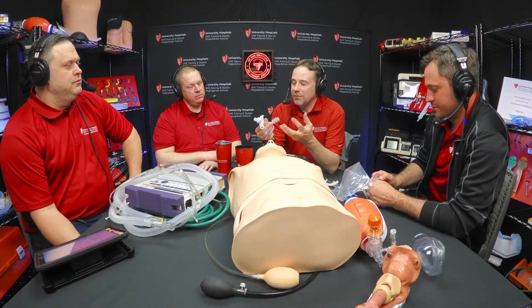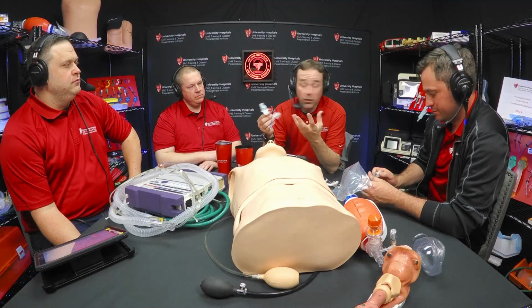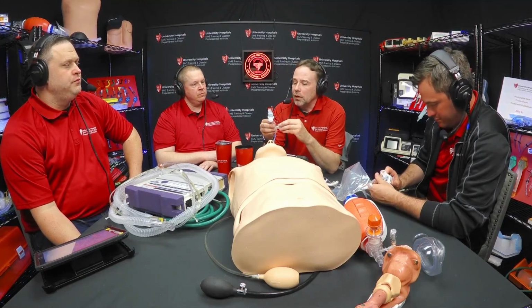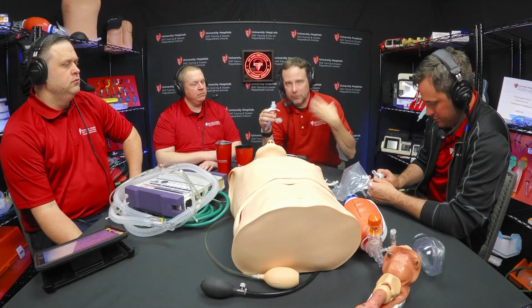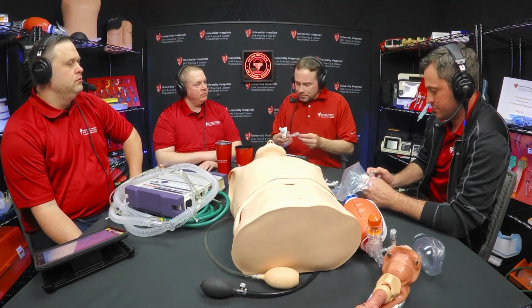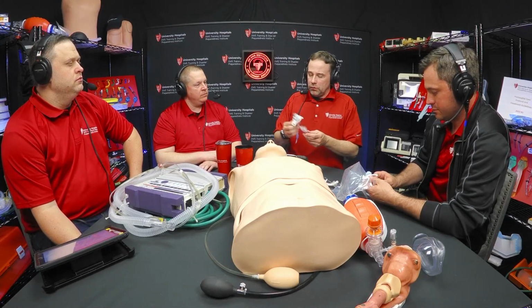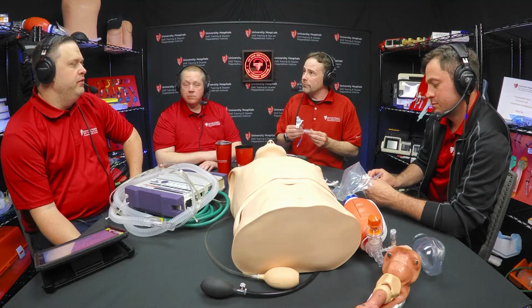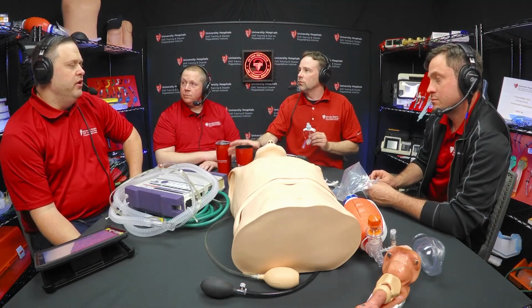And if that patient was breathing substantially on their own, you wouldn't necessarily need to bring that up or do anything, bag them. If they were awake and their sympathetic nervous system was intact and they were breathing on their own and everything was good. So, is there anything else you want to say about those patients or that population? Maybe I just see a lot of them that way. Just be leery of whether or not there's a cuff. Ask staff or the patient, hey, is this supposed to be inflated? When do you inflate it? Just getting that basic information is going to help you out a lot.